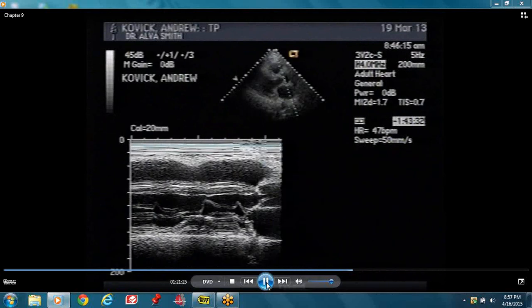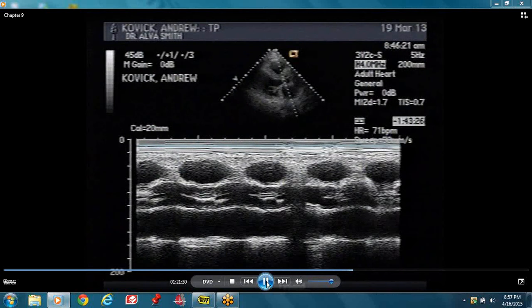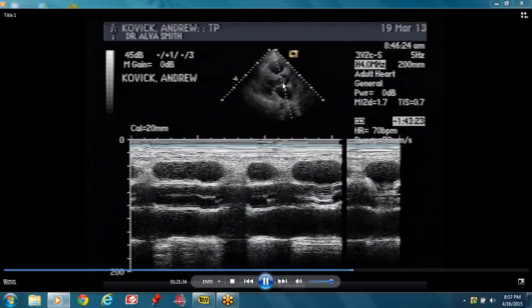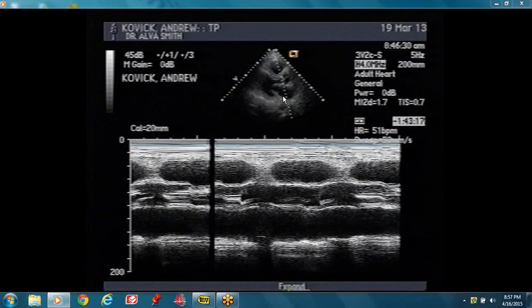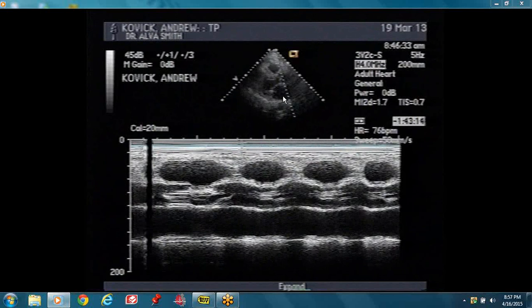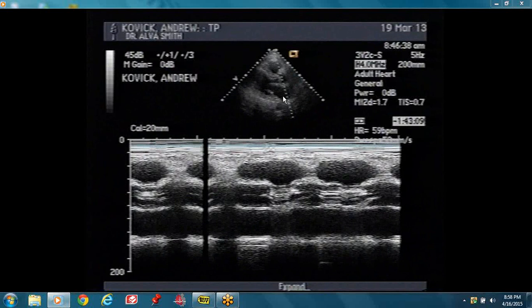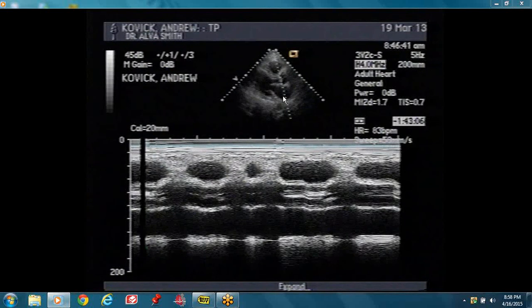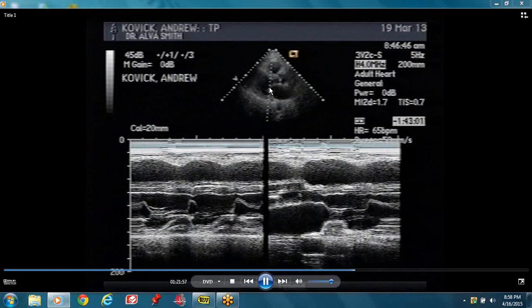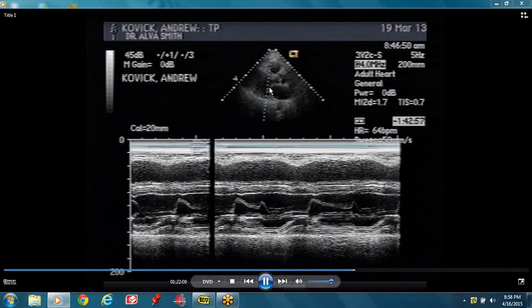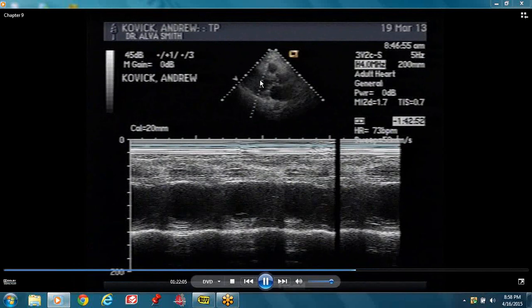The mid going to mid septum is not thickening properly because of a possible prior heart attack. The base is thickening okay. If you do M-mode across the aortic valve, the cursor goes across the aortic valve and the left atrium as well. We have a separate lecture for M-mode. It should be part of a routine exam — you do it across the aortic valve, then across the mitral valve, then towards the left ventricular cavity. Those are the three positions.